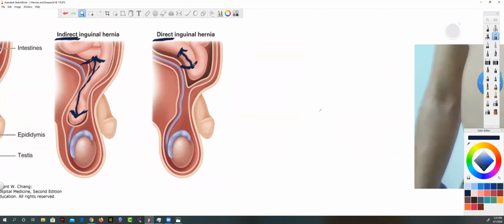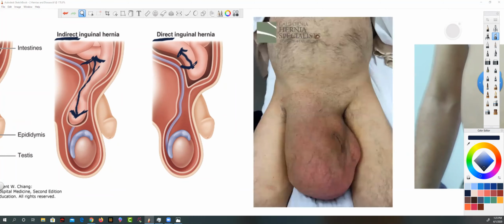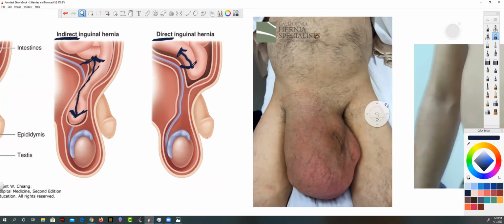Okay, I actually have a hidden picture here. I didn't want you guys to be scared or distracted by it, and I have seen these. I have done scans like this. Typically, this man has no access to medical care. It says California at the top. This has been many years with intestines. A large portion of his intestines is down in the scrotum here. If you're wondering where the penis is, it's hidden behind the tissue in there. It's been engulfed in all this extra tissue.